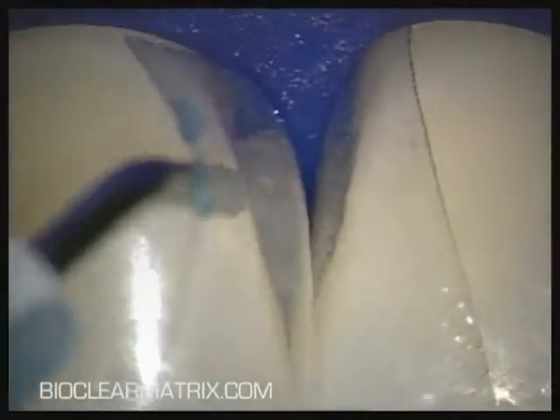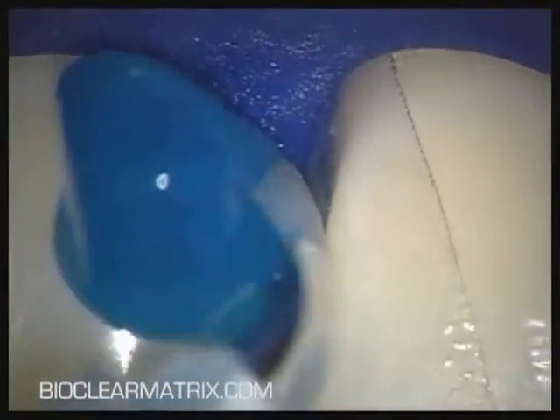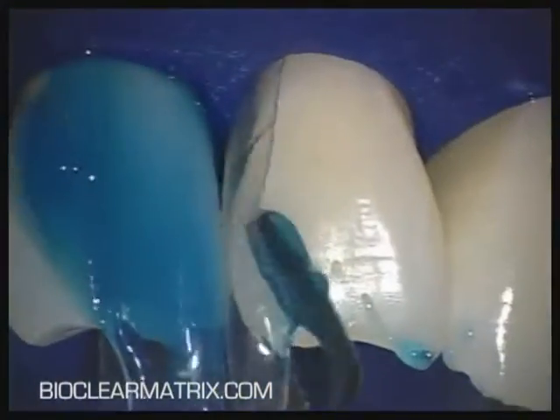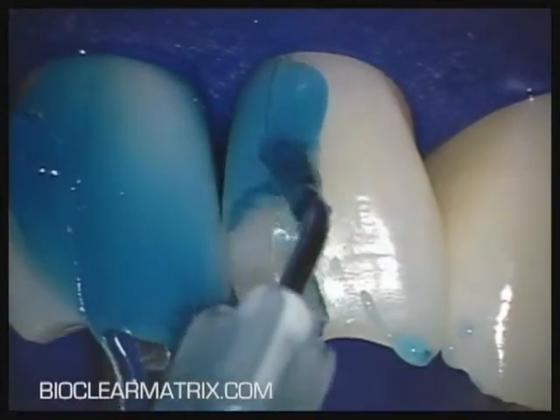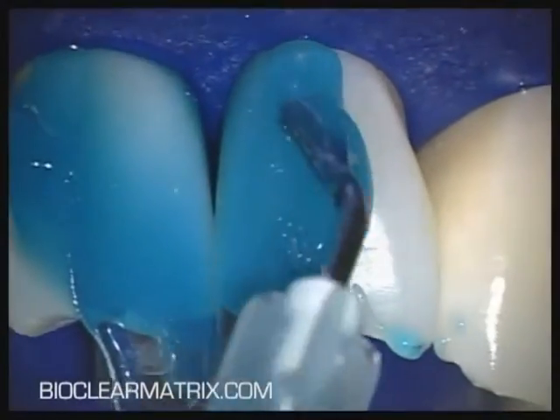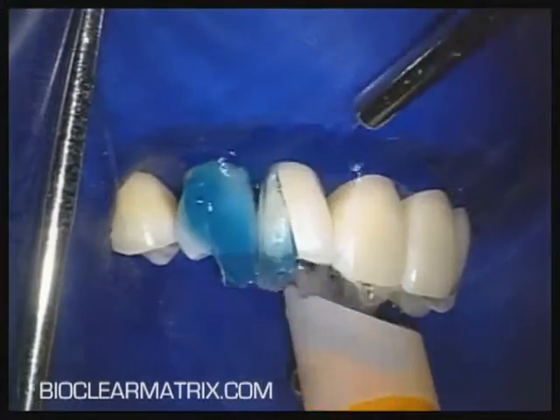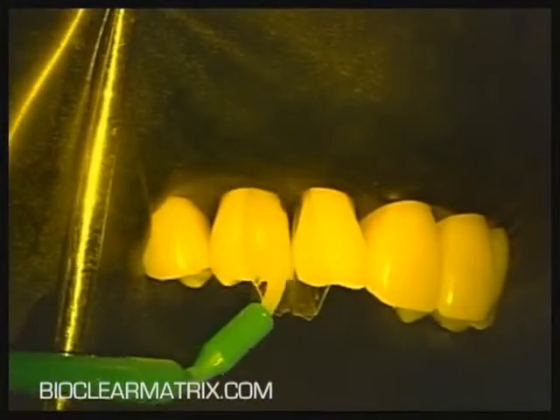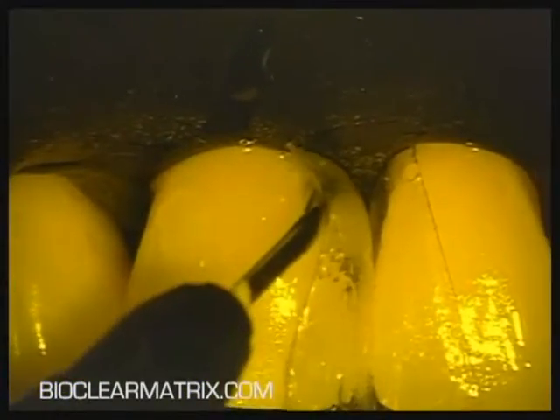You will learn to tease the BioClear matrix away from the tooth with etch tips, brushes, composite compules, etc. Alternatively, you or your assistant can pull the matrix open with an explorer to get access. Other than the use of the mild spray abrasive, no cutting of the tooth is necessary. Make sure and inject the flowable composite directly into the small pool of bonding resin at the gingival margin to avoid trapping an air bubble. I recommend injecting from both the facial and the palatal.